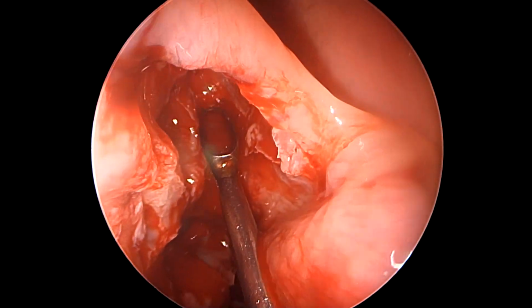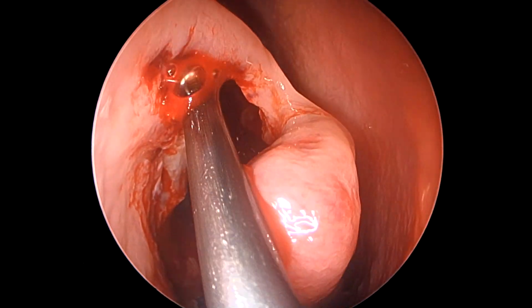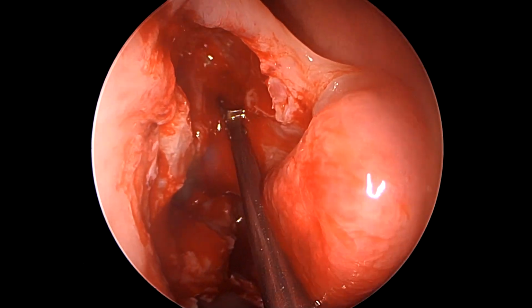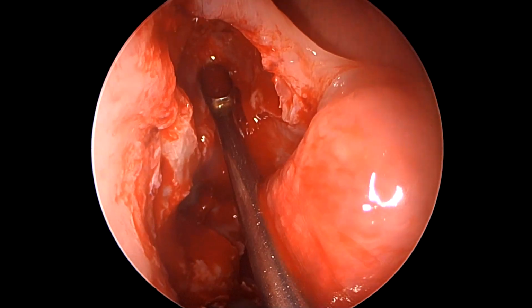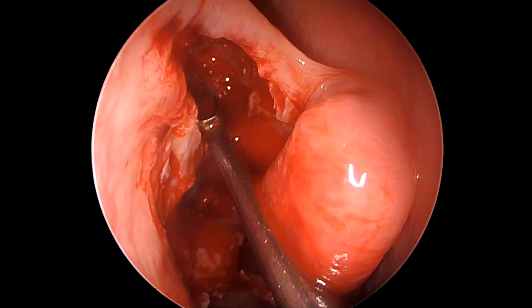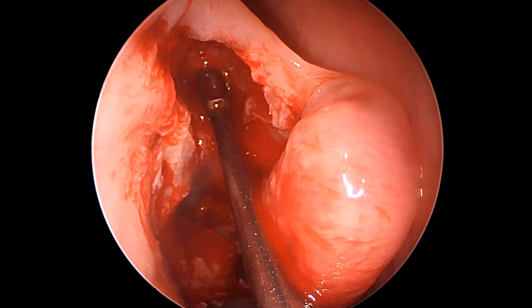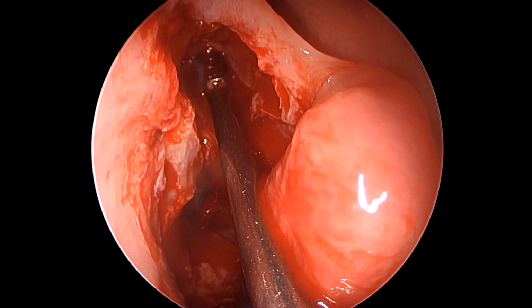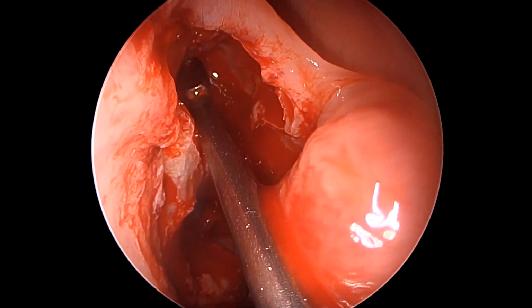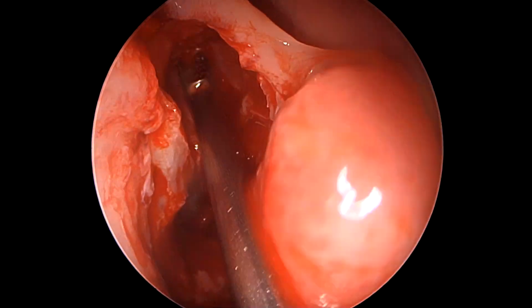And now we once again divert our attention towards the frontal recess. So here we are again using the frontal sinus curette, and we are gently using this instrument to palpate the cells one by one and make sure that we do not use any force. We are just trying to insinuate our curettes within the recess and find the path of the recess, which sometimes in these situations, where there is more than one cell above the agger nasi, can be quite tortuous. So finding the right plane in which to back fracture these cells is very important and must not be taken lightly.